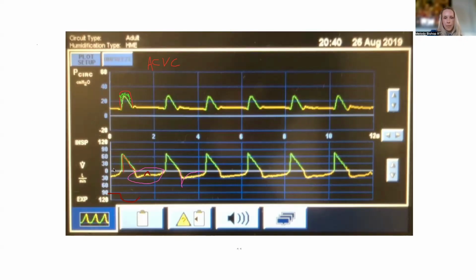So throughout inspiration and certainly expiration, the patient's pulling down the whole time, which number one, I can't imagine would be comfortable. And number two is certainly not safe, let's say for diaphragmatic purposes, right? Because on every single breath, the patient's doing the same thing. So the patient's working super hard to breathe on these settings, whatever the flow is, and also whatever the volume that whoever set the ventilator chose.